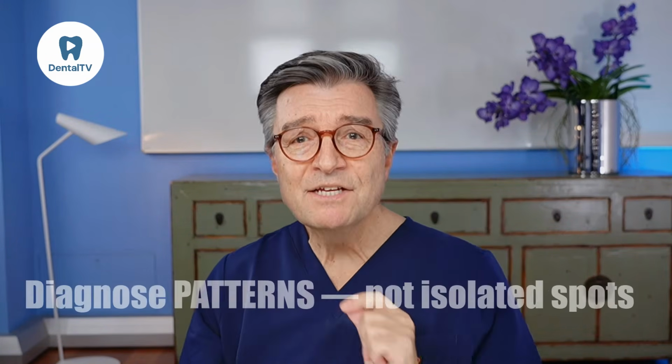Principle number 2, anatomy first, pathology second. You never diagnose pathology before confirming normal anatomy. Your anchors are the lamina dura, the PDL space, cortical borders, the crestal contour, and the symmetry from right to left. Everything else is a variation on these anchors. Principle number 3, diagnose patterns, not pixels. Dental school taught us to look at dark spots, but in real diagnostics, isolated radiolucencies mean nothing. We diagnose from patterns, symmetry, borders, density, shape, continuity, and correlation with the clinical examination.